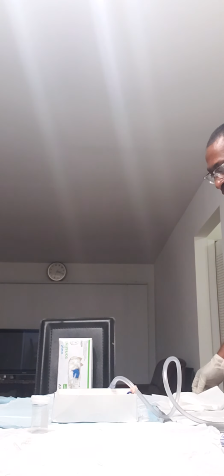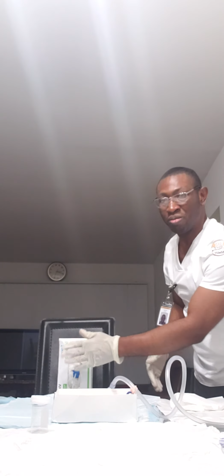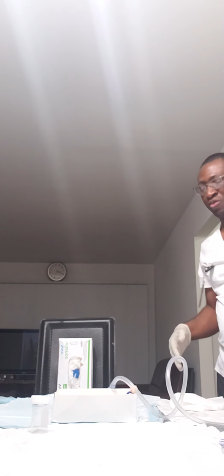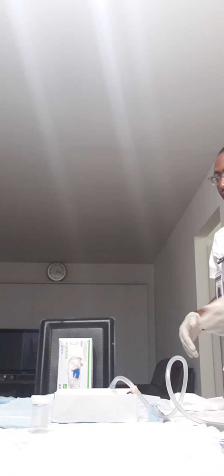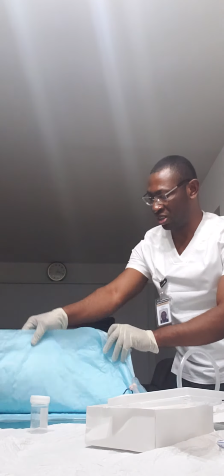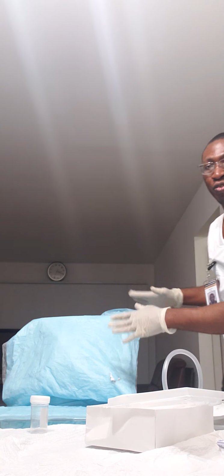When I'm done clipping it to the bed, the next thing I'm going to do is clean up my patient, do perineal care as needed, take off everything here, clean up the place and wipe it off. After wiping it off, the next thing I'm going to do is cover my patient. After covering my patient, I make sure he's comfortable.